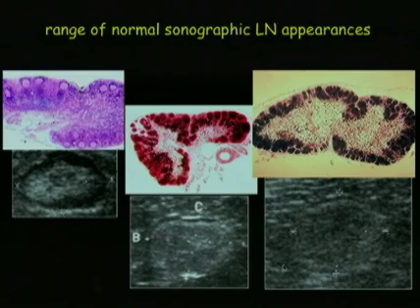Number one, we recognize that on a mammogram, lymph nodes have a fatty hilum, and we recognize on ultrasound that fat is isoechoic or mid-level gray. So we had this discrepancy of why something that should be fatty is hyperechoic rather than isoechoic on ultrasound. And the explanation is that the hyperechogenicity is not the fat, but simply the interfaces between the medullary cords and sinusoids.